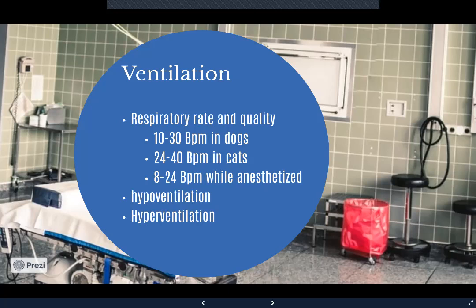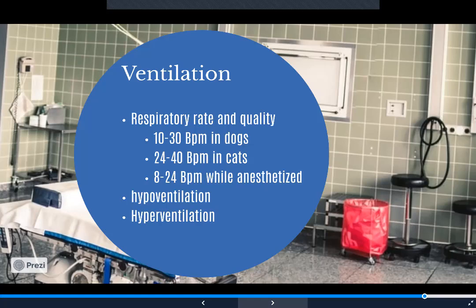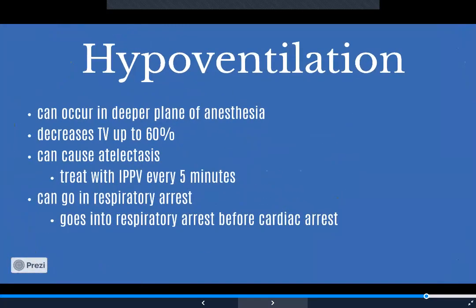And that's why we do give them breaths while they're under anesthesia, because we really want to exercise their alveoli. So we have to monitor them for any type of hypoventilating or even hyperventilating. And there's many reasons why that can happen, right? So we'll obviously talk a little bit about that.